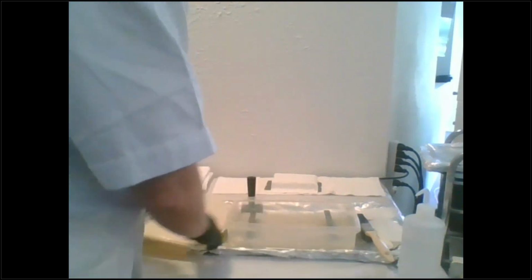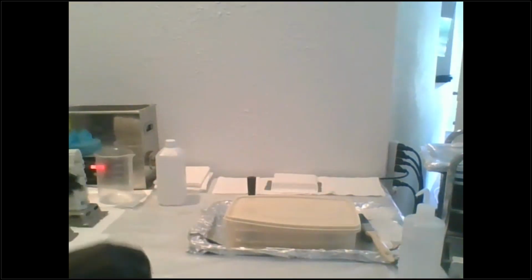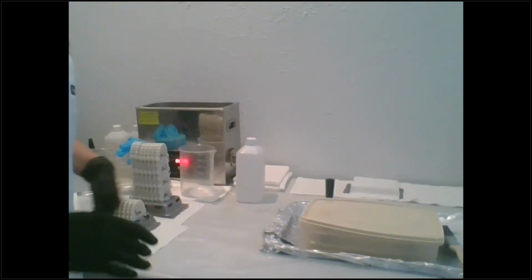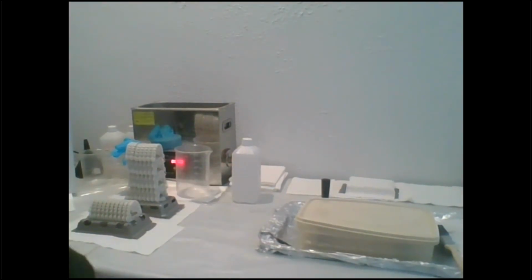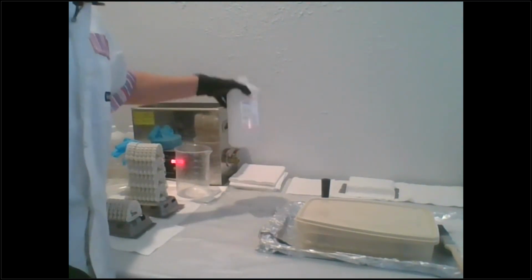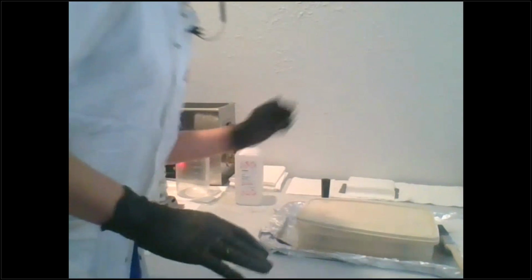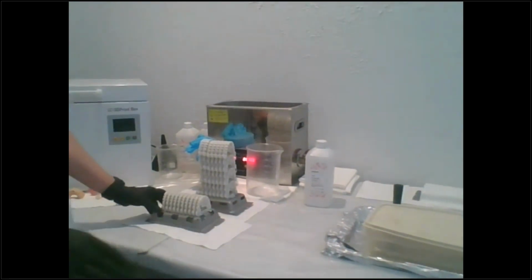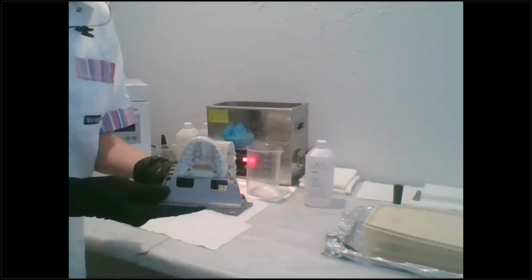Perfect amount, and I recycle all my alcohol basically into here. So I've got 3 different levels of alcohol that I have, and it always ends up in here. This is the very last hurrah for that alcohol. You're always going to use 91% IPA, and I have my build platform area where they're drying. I have my stacks here, and this is the single level stack I showed you.